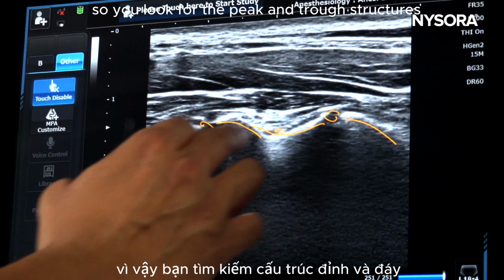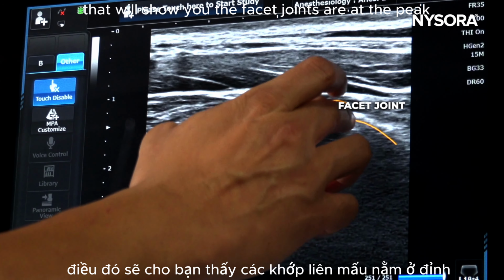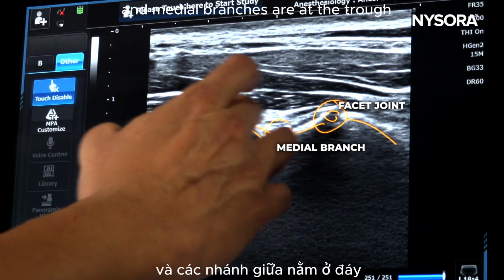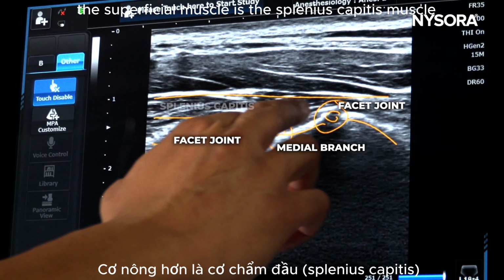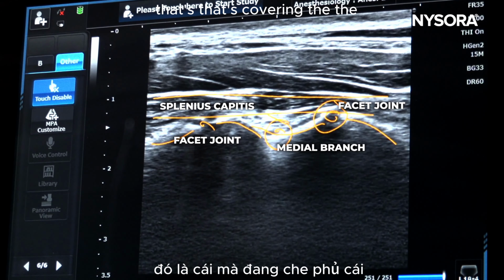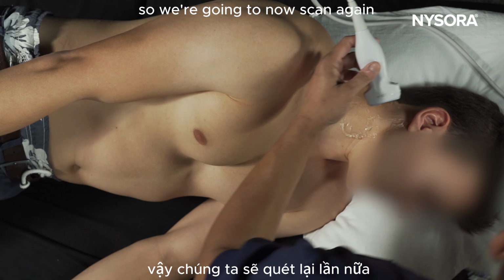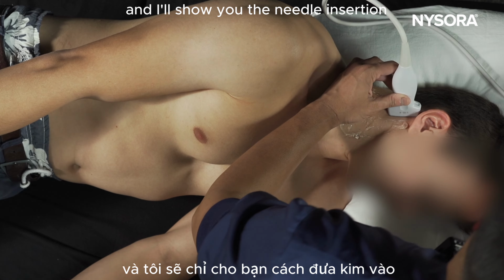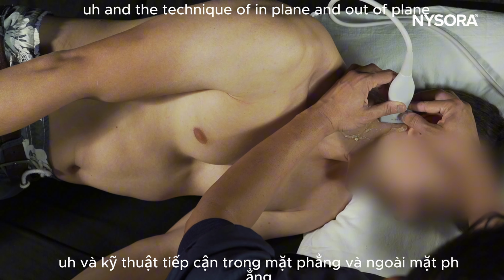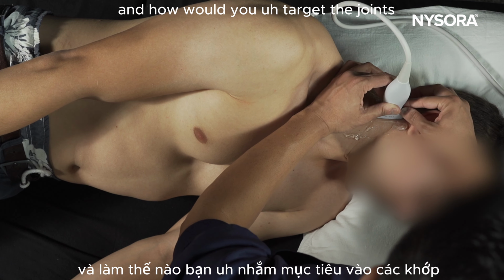Then you have another peak, that's the joint, and then you have a trough. So you look for the peak and trough structures, which will show you the facet joints are at the peak and medial branches are at the trough. The superficial muscle is the splenius capitis muscle that's covering the facet joint column. So we're going to now scan again, and I'll show you the needle insertion and the technique of in-plane and out-of-plane, and how you would target the joints.